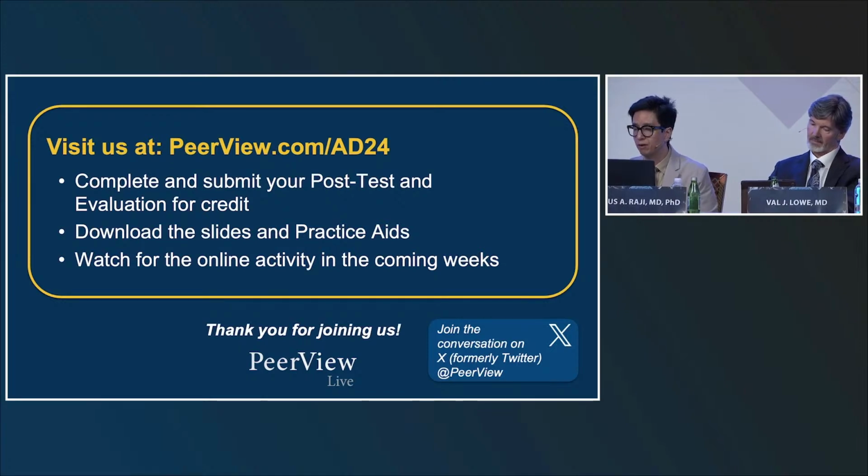I can take that one. I understand your point, and I've also thought of the Fazekas 2.5 issue. The issue with white matter hyperintensity volume from a segmentation standpoint is these algorithms often miss the posterior fossa. So trying to track the posterior fossa, especially if there are brainstem white matter hyperintensities, which can happen in severe hypertension, is a blind spot there. I think newer algorithms pairing it with T2, which tracks the posterior fossa better, will be the way to go. And yes, having volumes will be an important way to track this in the future, but ultimately your opinion as the neuroradiologist will also stand, and sometimes there will still be some ambiguity between 2 and 3.